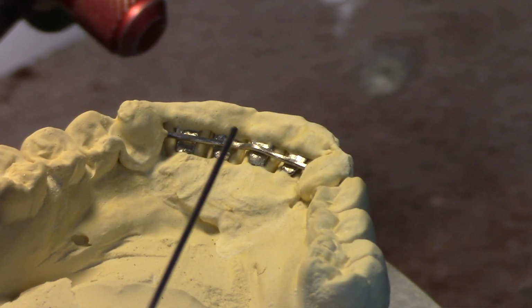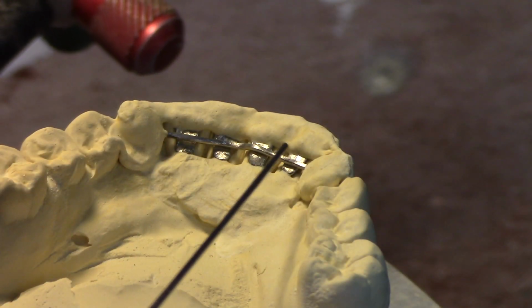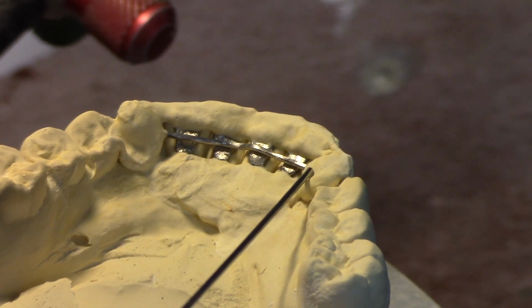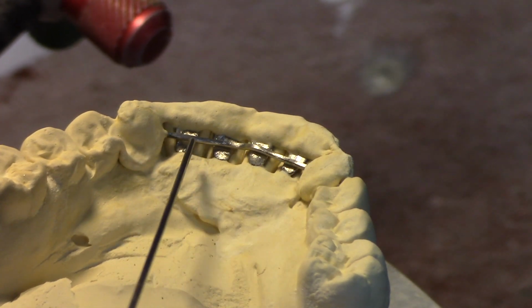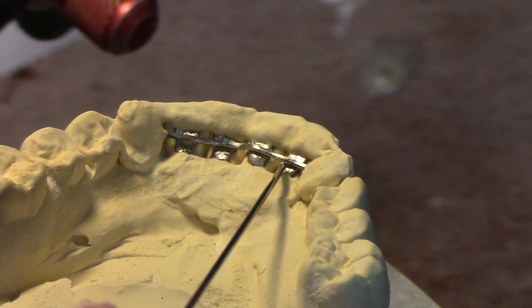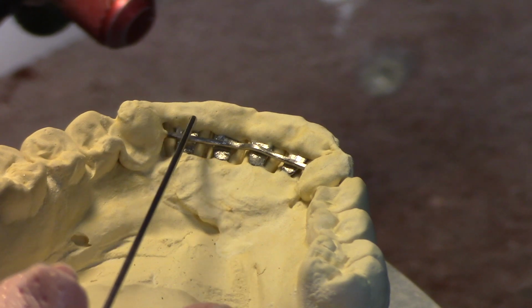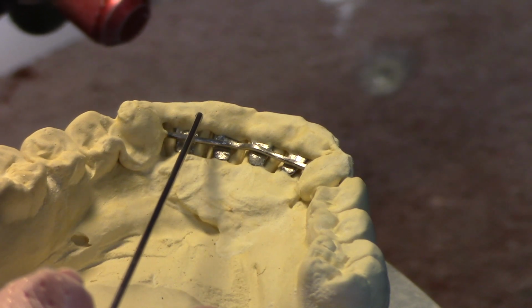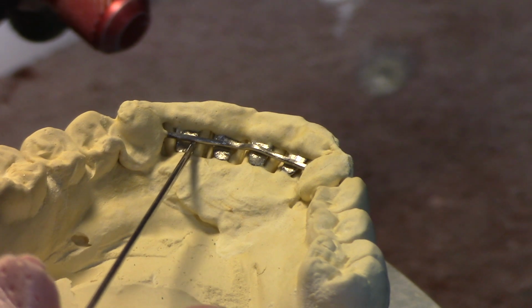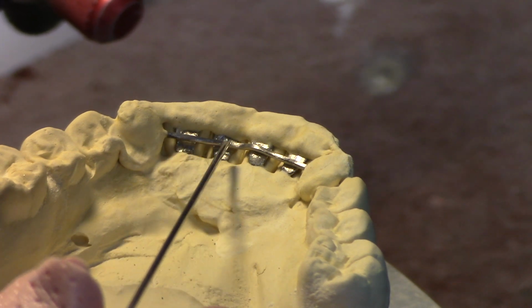What I have here is a preformed 3-to-3 lingual arch that's got the pads on the cuspids, and they're covered up in plaster right now. And then I've got individual pads that I've roughened up and I've super glued onto the incisors. And I put just a touch of super glue on the superior border and let capillary action pull it down into the padded area just to hold it in place.